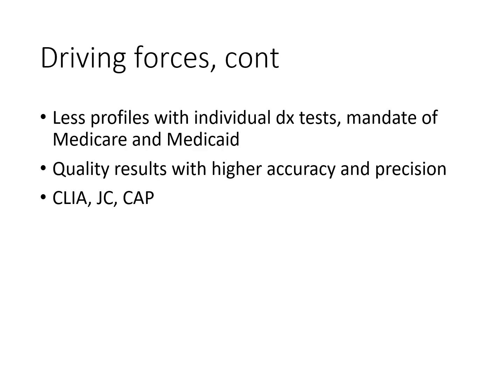Some more trends. We also have fewer test profiles and more individual diagnostic testing. And that was a mandate of Medicare and Medicaid and what they would and would not fund. That kind of helps to influence what we're doing. There's an emphasis on quality results with high accuracy and precision, and regulatory oversight from CLIA, Joint Commission, and CAP.